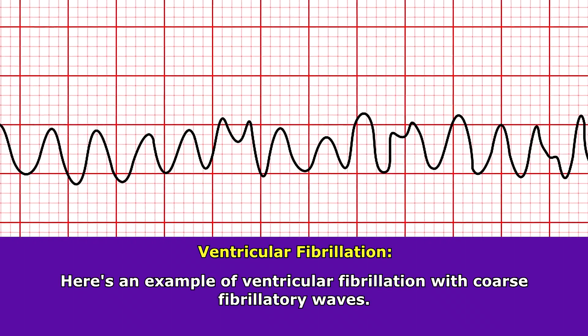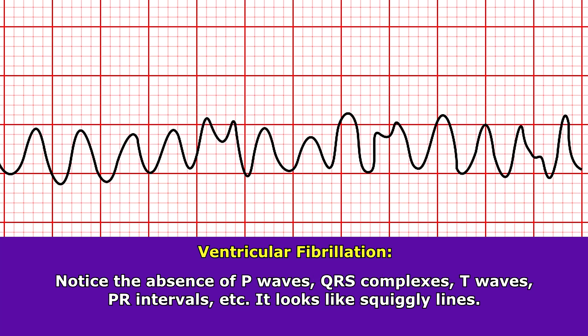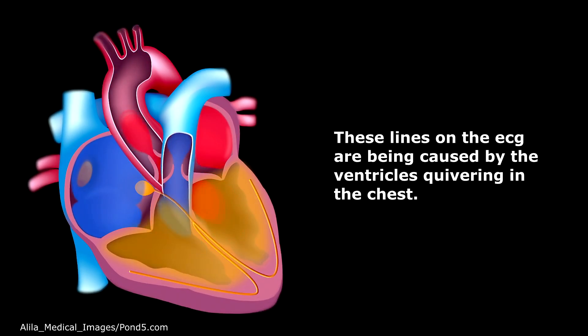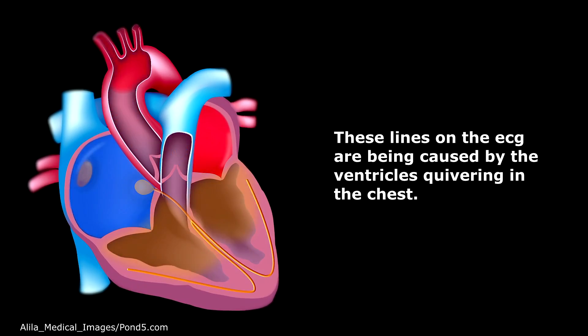This is actually coarse fibrillatory waves. Notice you cannot find P waves, QRS complexes, or T waves — really what it looks like is just a bunch of squiggly lines on the ECG strip. And these lines are being produced from our ventricles, which are just sitting in the chest quivering, not contracting like they should.